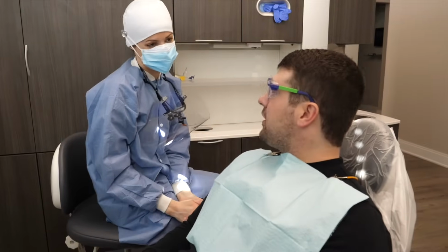You know yourself best. You know if you have the discipline or not that's required to choose this teeth straightening option. So if you are someone who doesn't want the responsibility of these aligners, or you are worried it will take forever because you know you'll end up forgetting to put them on every day for 23 hours each day, or maybe if you're someone who wants them but does not qualify as a clear aligner candidate, which your dentist will let you know if you are or not after your consultation.